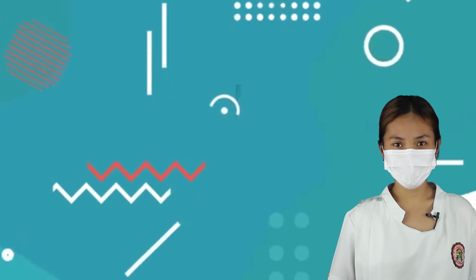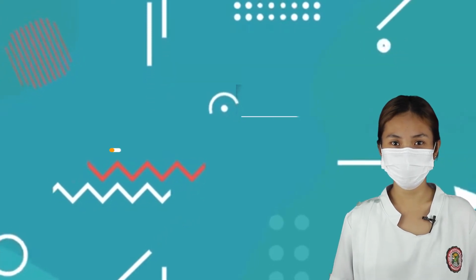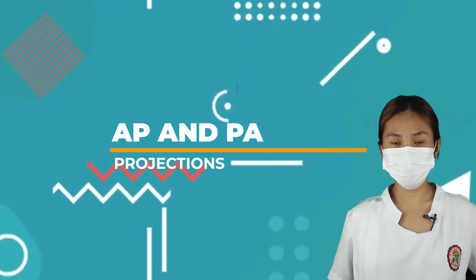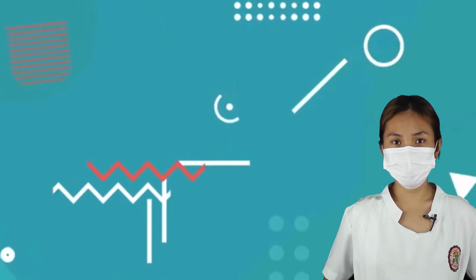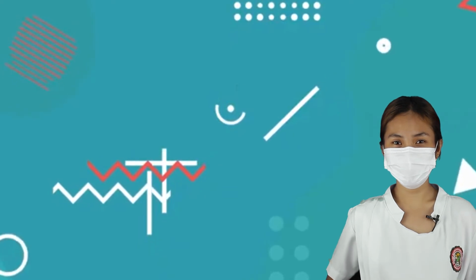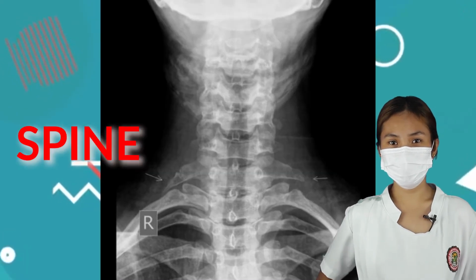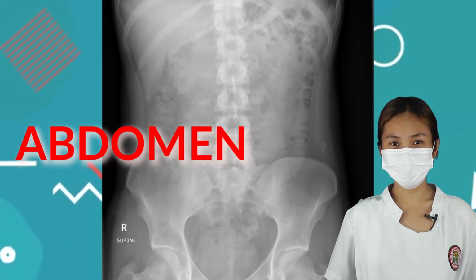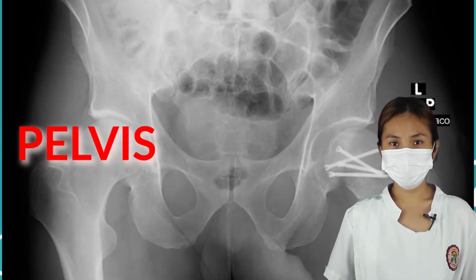A right marker is often used in AP and PA projections that encompass both the right and the left sides of the body, such as the head, the spine, the chest, the abdomen, and the pelvis.